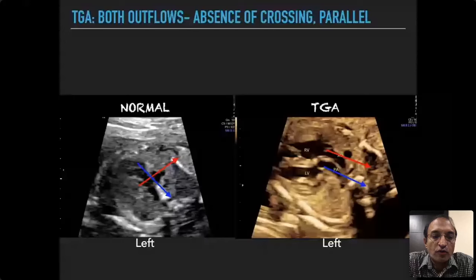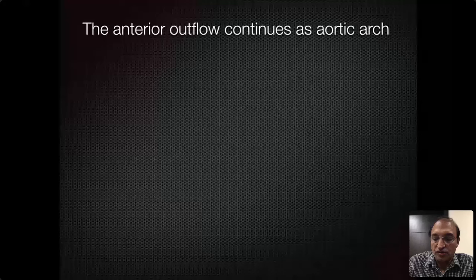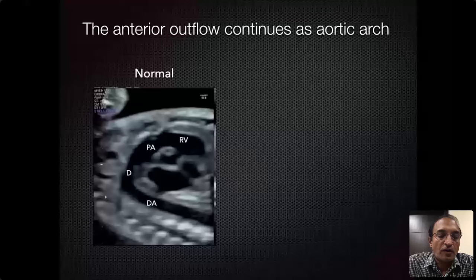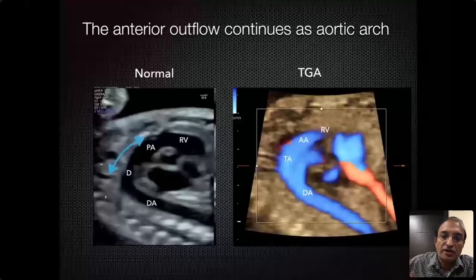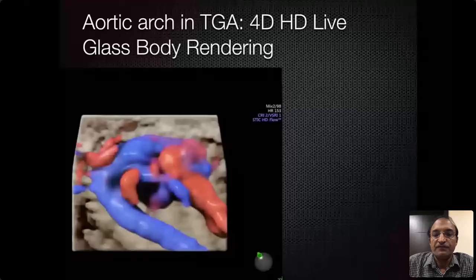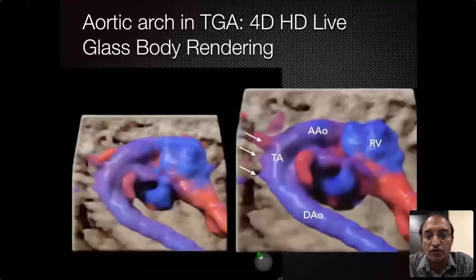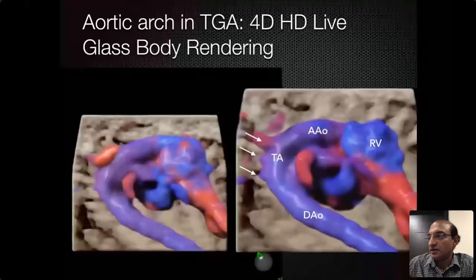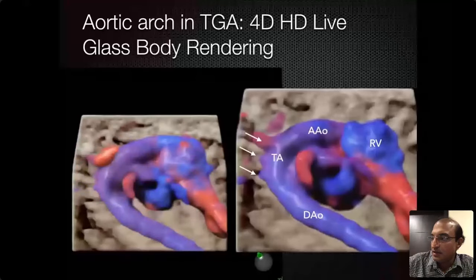In TGA, demonstrating the loss of crossing is very critical. The anterior outflow in TGA continues as the aortic arch, whereas normally the anterior outflow is the pulmonary artery continuing as the ductus arteriosus. There is a characteristic curved continuation of the anterior vessel as the aortic arch, beautifully shown in this 4D rendered picture — you can see the aortic arch with its three branches arising from the right ventricle as the anterior vessel.